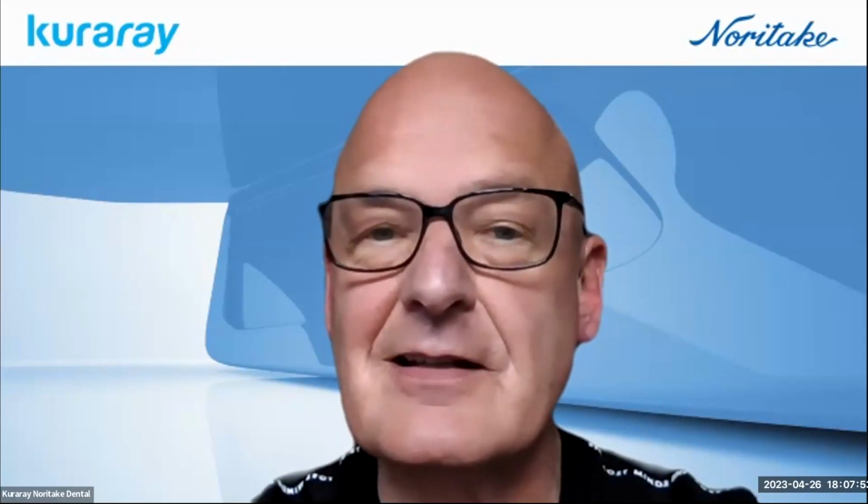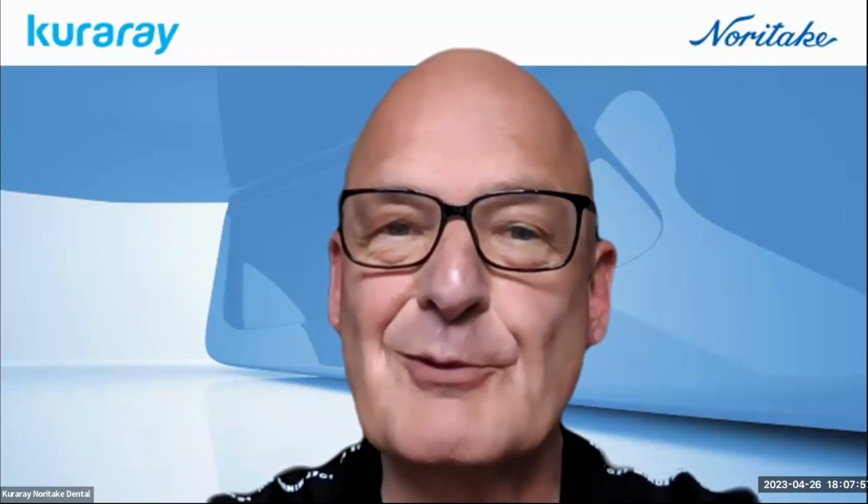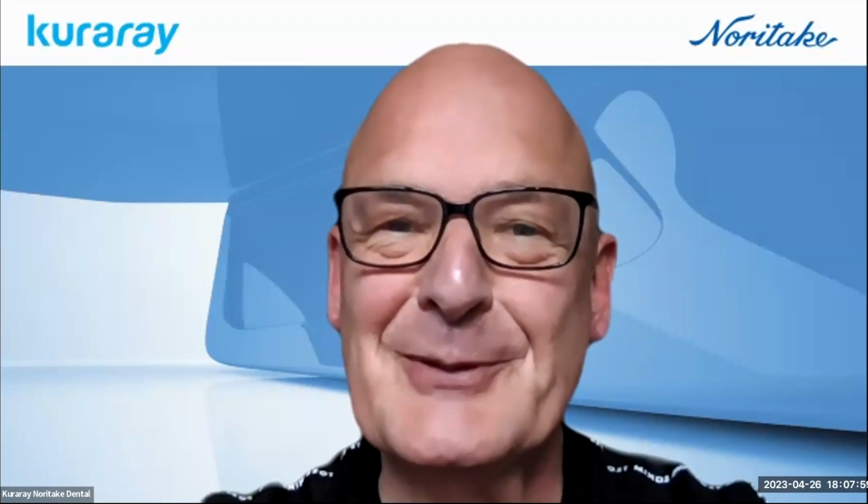Yes, especially when you're making a class 2, I always connect flowable with the normal regular composite, so it's normal for me. I use both of them when I want to restore this kind of decay. But I think nowadays, Michael, you say normal composite, but nowadays the flowable is more normal for you than the old normal. Yes, in fact, I'm using this much more often than the regular composite.